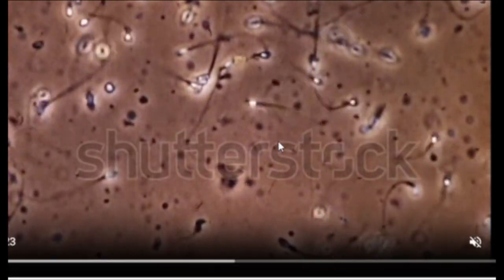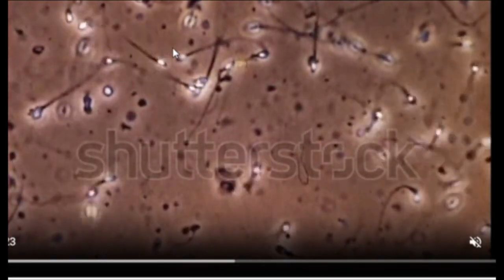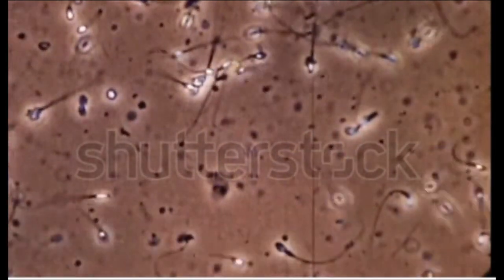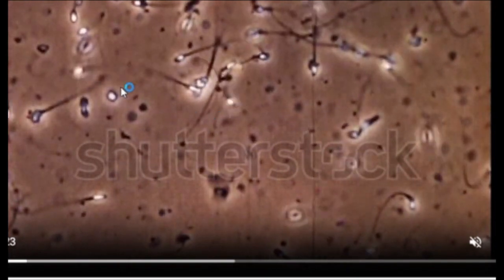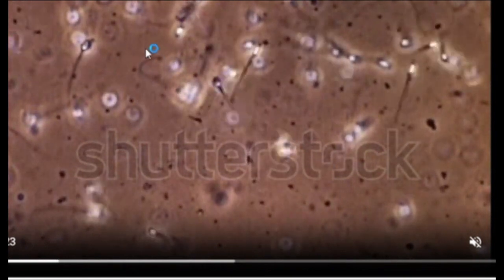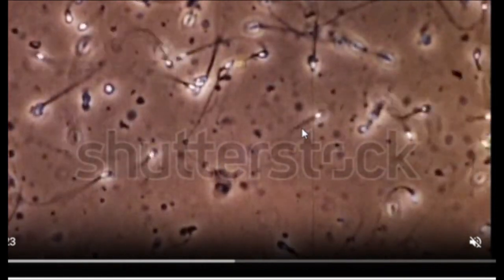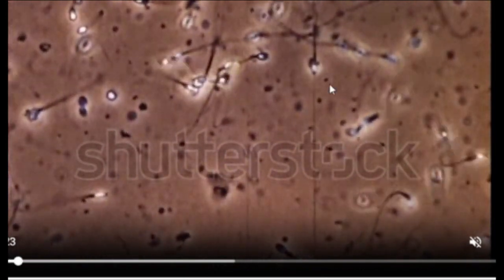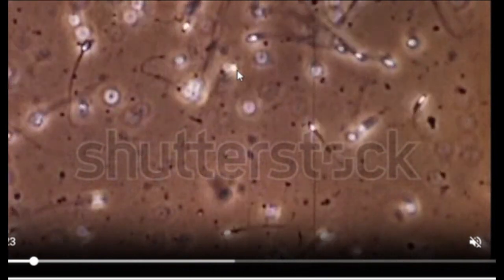In this slide you can see sperms which are rapidly progressive. They are moving very quickly, either linearly or in large circles, and traveling from one point to another point. You can see that they are moving from one point to another very quickly. The distance is more than half the tail length. Within 1 second they are moving from one point to another.